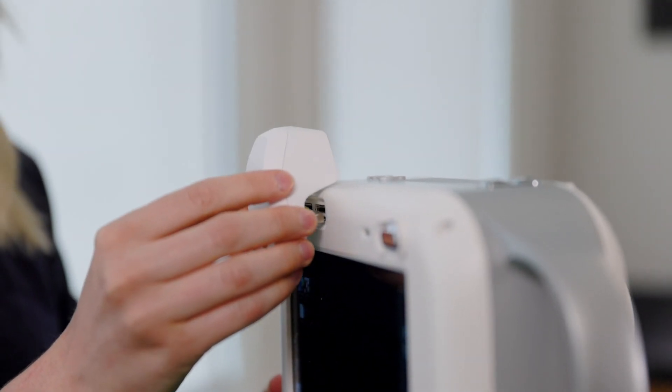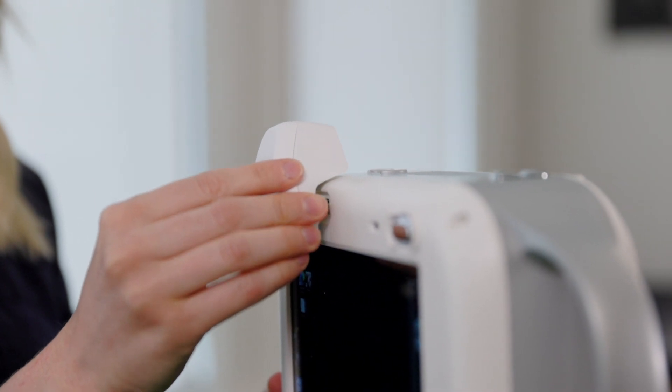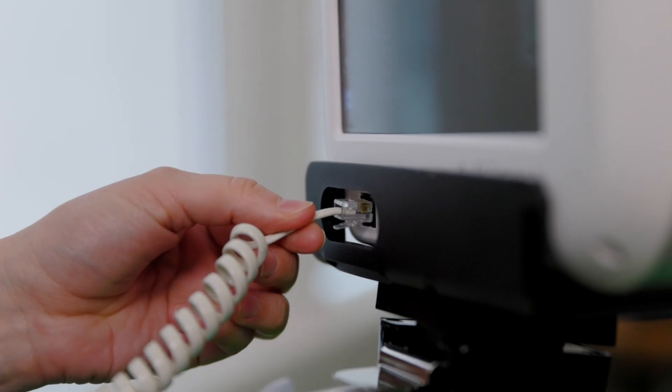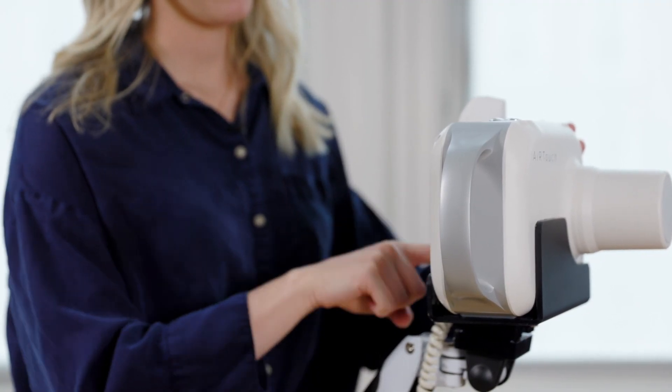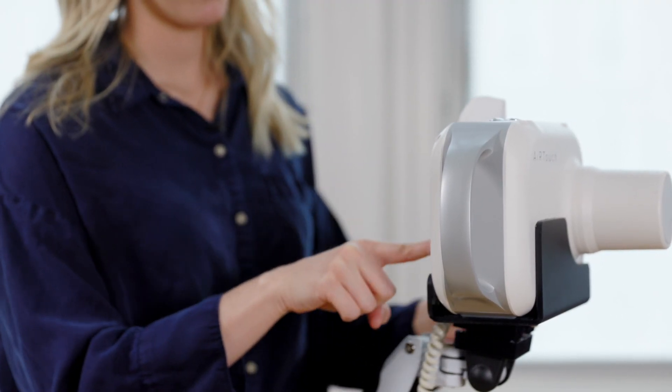Next, we are going to x-ray a skull phantom to demonstrate the acquisition process. To set up your Europa, the first step is to plug in your laser light to ensure alignment. Then plug in the hand switch. Next, open the DR acquisition software that's connected to your flat panel detector. Open your patient study and once the detector is ready for exposure, set the proper technique on your Europa system.